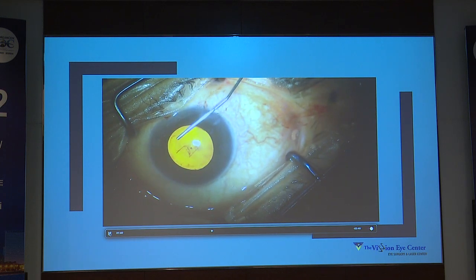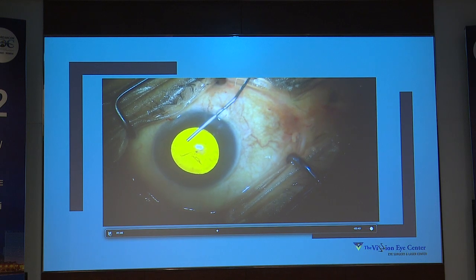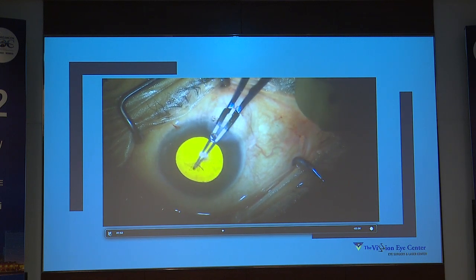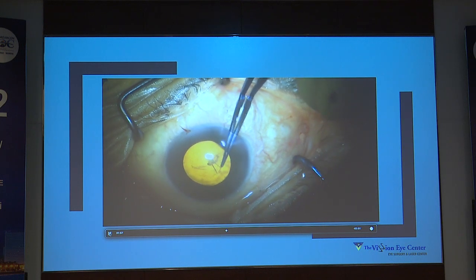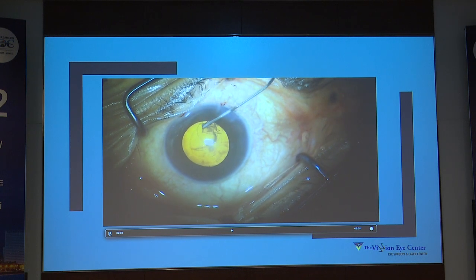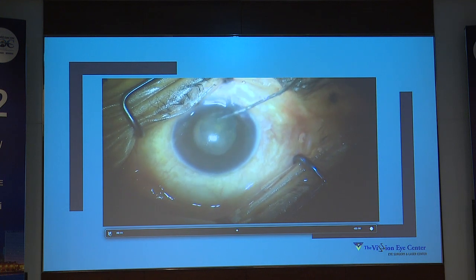I'm refilling the chamber again because if the chamber shallows, your rhexis becomes smaller. And then you have even more trouble because the success of this surgery is only on the rhexis. If you've got a big, good enough rhexis, you will not tear it, you will have good access to your nucleus. And 80% of the success in such cases is from a good rhexis. Take your time, because if you goof up somewhere, that's the place which will give you trouble till the end, including phimosis in the end.